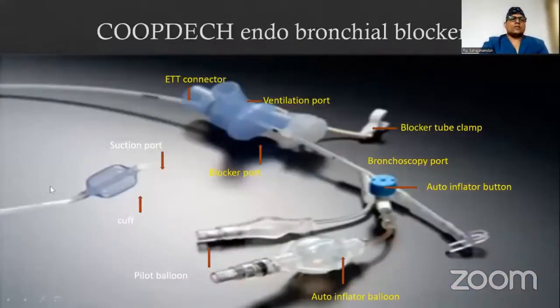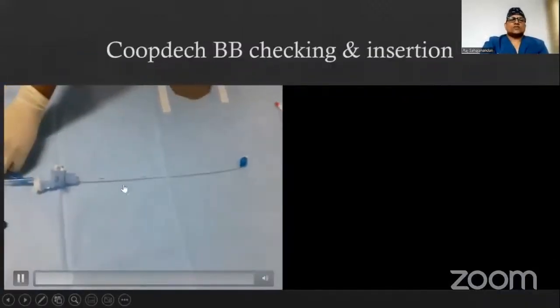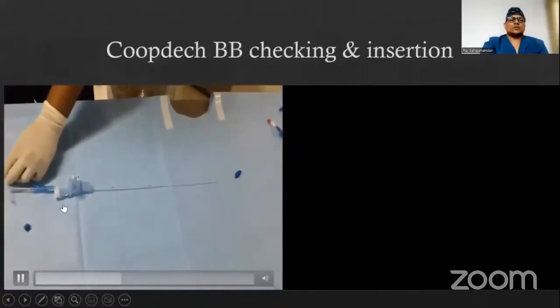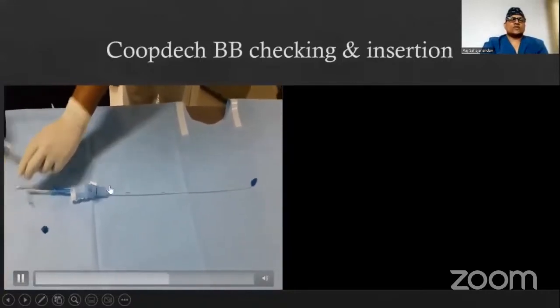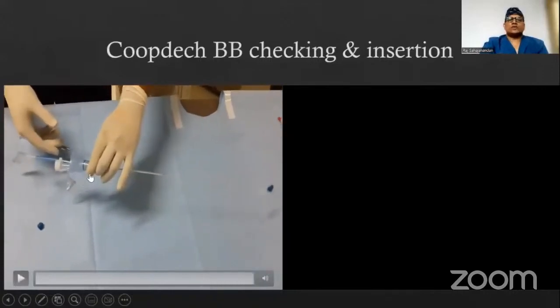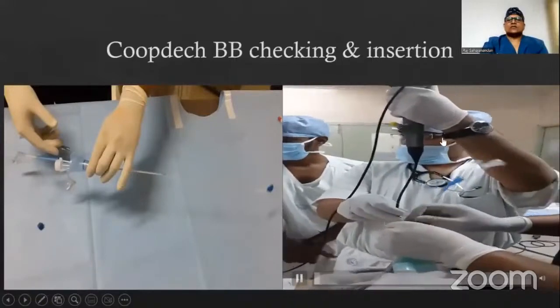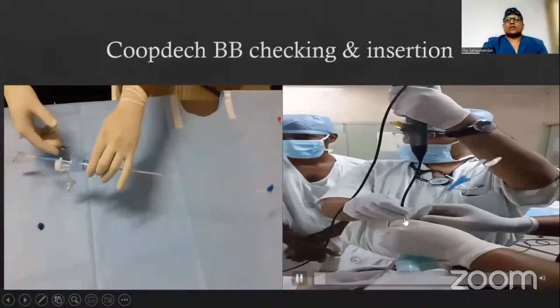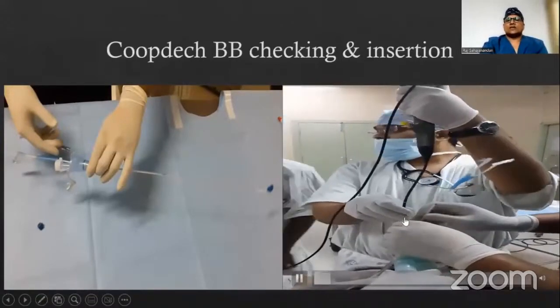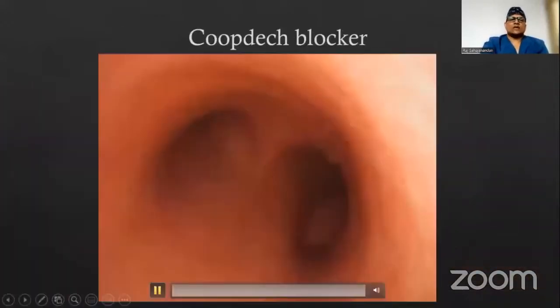Coming to the next blocker, which is a Fuji blocker and a Coopdech blocker. Both of them work on the principle of an angled tip. Here again, you should check the integrity of the cuff. All these also come with a multi-port adapter, which is a slightly different design but works on the same principle. Here the assistant's job is to be a cameraman. He guides me. He doesn't have to do anything, but he should be a good cameraman. So we'll see what happens.